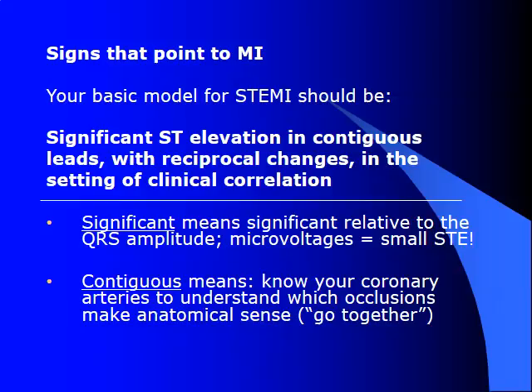Significant means significant relative to the QRS amplitude. So if you have a tiny QRS with moderate ST elevation, this is significant, even though the amount of ST elevation is minimal. The smaller the QRS, the less recognizable your ST elevation is going to be.